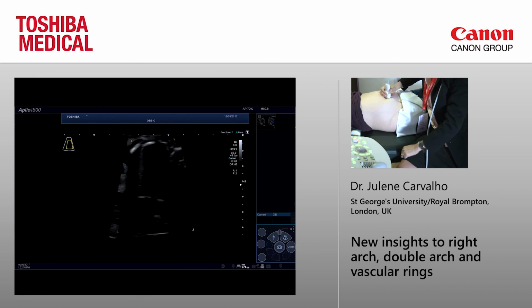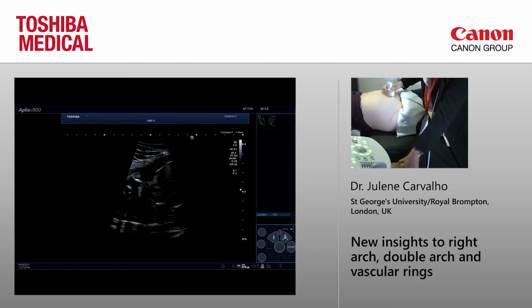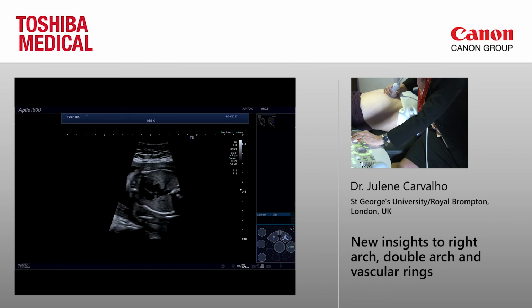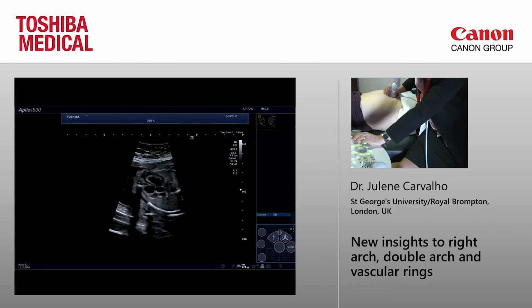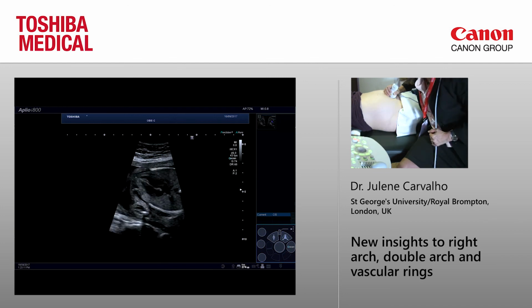Okay, I think I had about 5 minutes. Anything that you want me to show, or you're very quiet? Everything seen? Clear? I try to concentrate on the arch and duct, but is there anything else you want me to show, or shall we move on? Yeah. Can you show the innominate vein again? To show, sorry? Innominate vein.